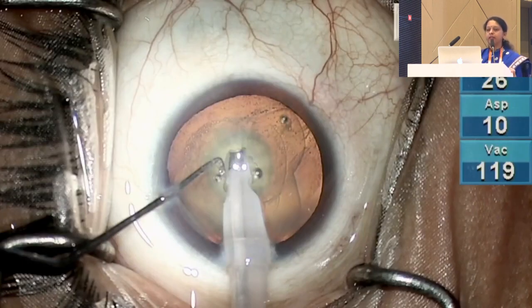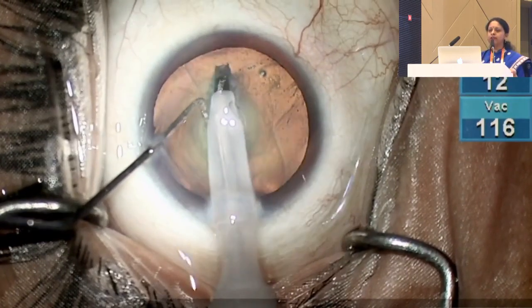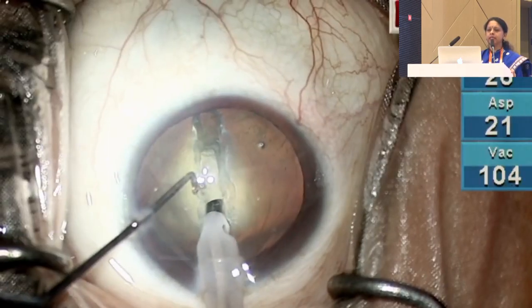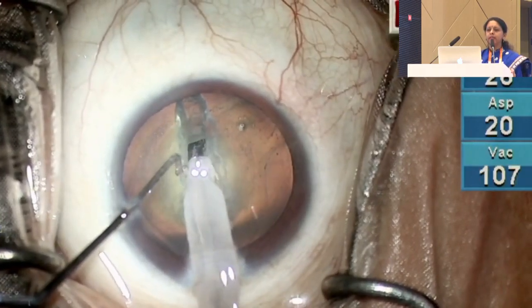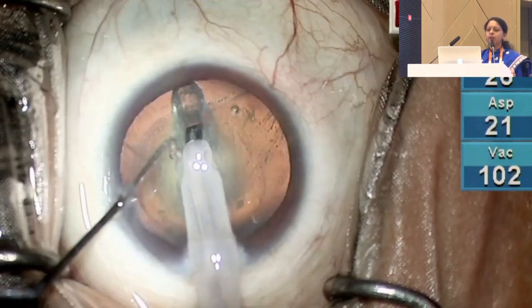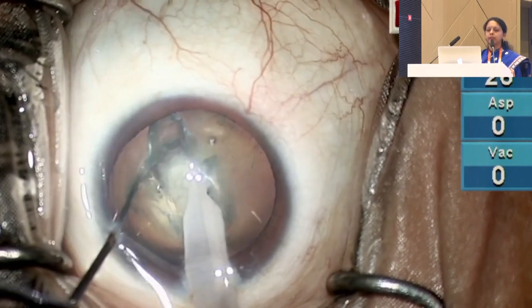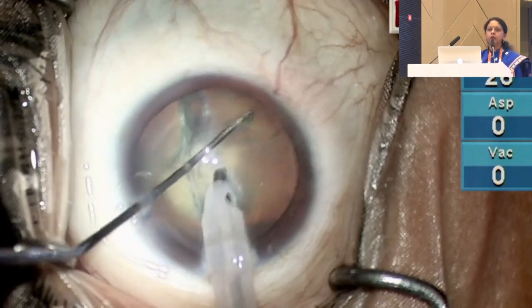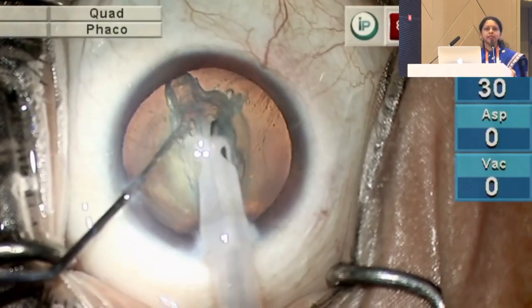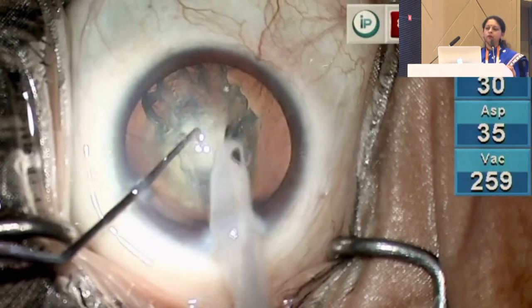Now the case begins. We can see that it is a very soft cataract. We can visualize the tear also, which is pre-existent. And being a very soft cataract, after doing a trenching, it is not possible to separate the nucleus. And now we are in a no man's land. What to do? Because the PCR is already there and the nucleus is not separated, what to do?